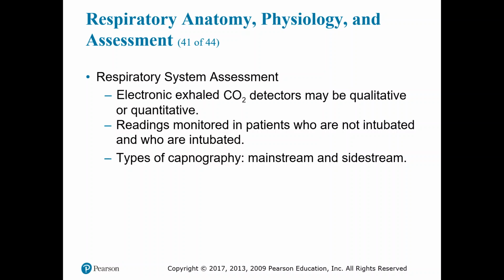With side stream, a sample of the gas is aspirated from the main gas flow circuit and taken through a sampling tube to the monitor that is away from the patient. The sample line is attached to the sensor unit that is typically housed inside the monitor, like the LifePak 15 or the Zoll M series or X series. So you have a little bit of a delay.